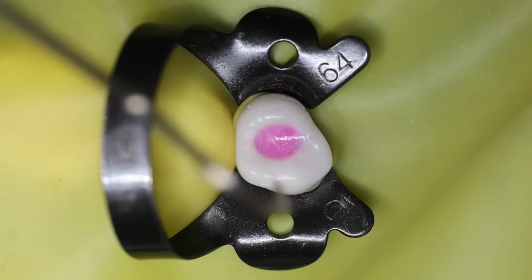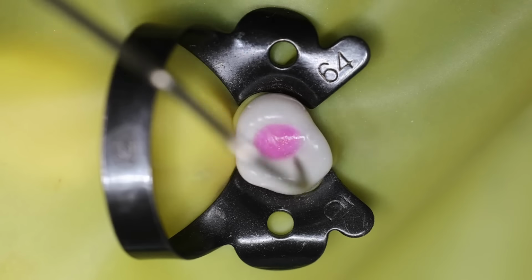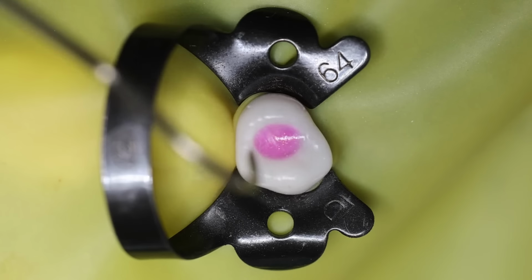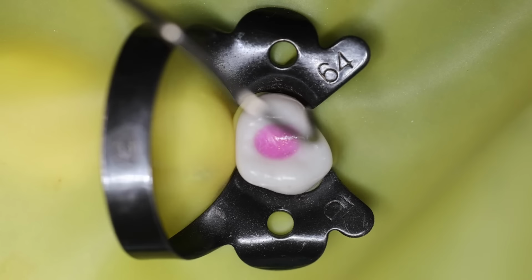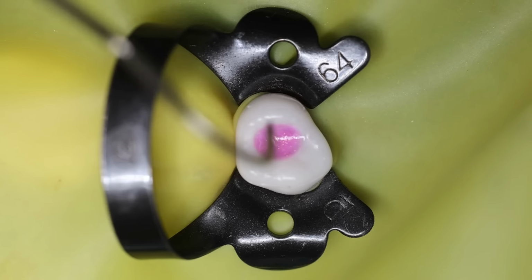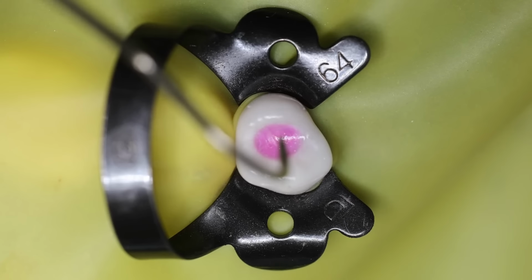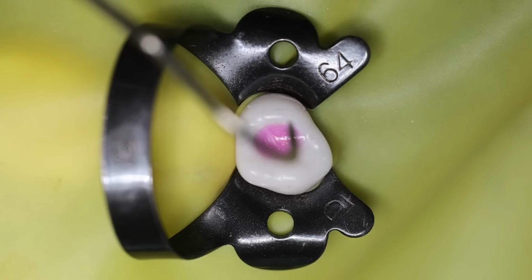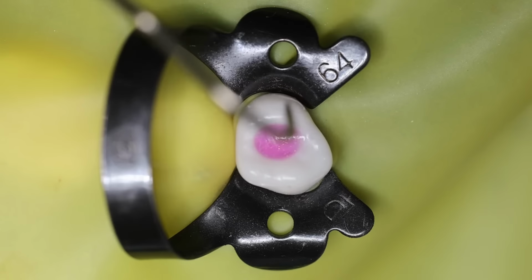Suppose now this demonstration is regarding pulpotomy, and today we are going to learn about MTA pulpotomy, mineral trioxide aggregate pulpotomy, because this is considered the gold standard for pulpotomy treatment in primary teeth. Okay, and we assume that this case has a caries that is involving the pulp.